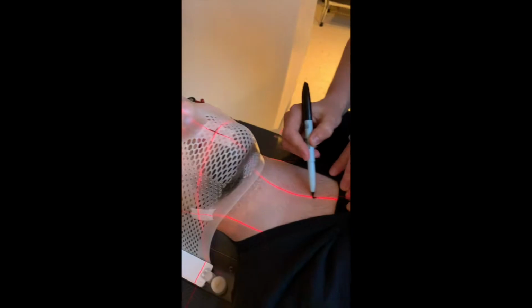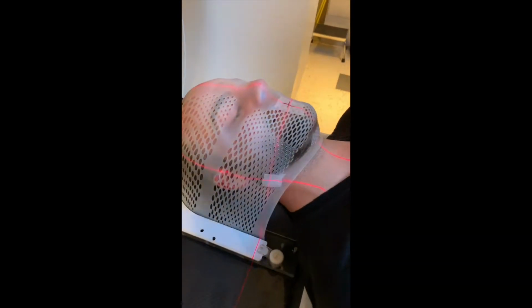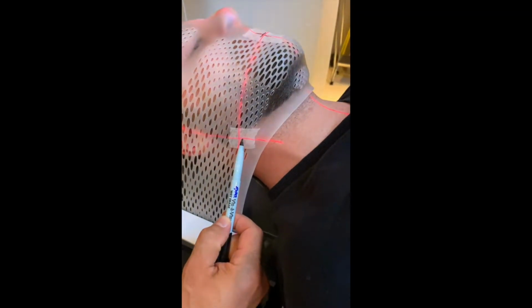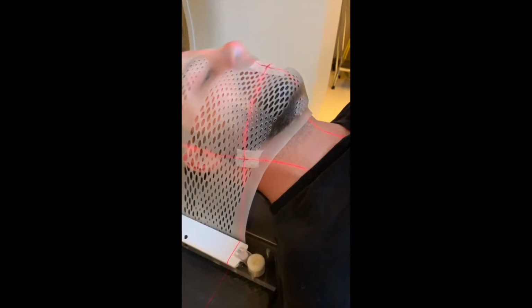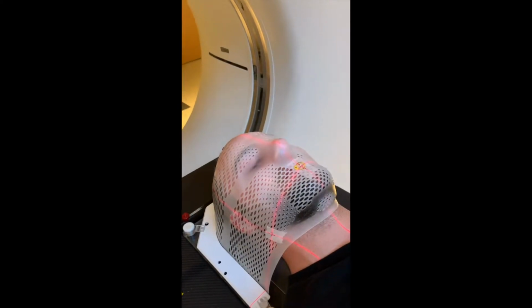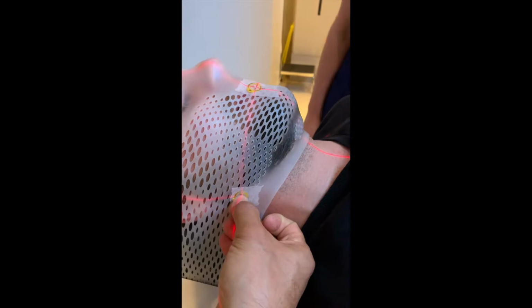To further help with your setup, we will make reference marks on your skin that we can use with our external laser system. The laser system is calibrated to line up the same both in our CT simulator and out on our treatment machines. This is done to ensure that we are able to accurately line you up down to the millimeter. In order to use these reference marks, we will place BBs over them, which will show up during the CT scan.